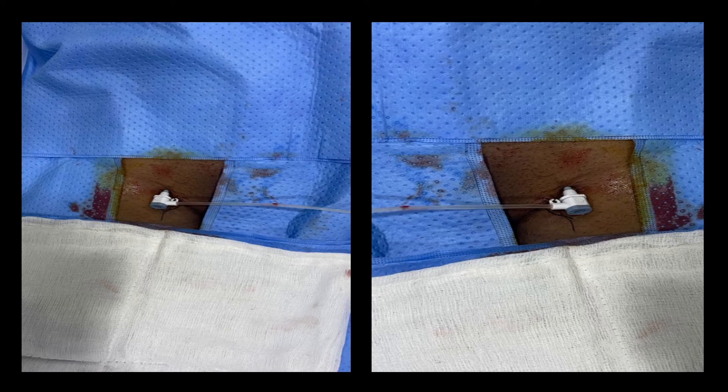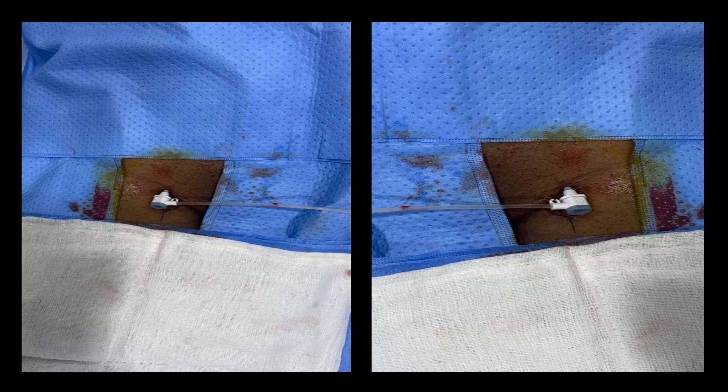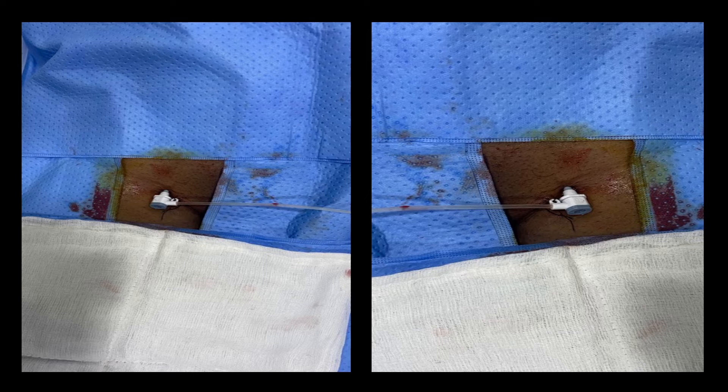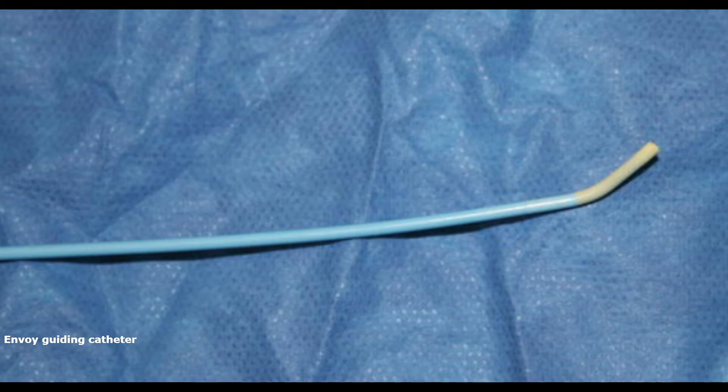After obtaining proper patient consent, the patient was shifted to the DSA suite and placed supine. General anesthesia was administered, bilateral groin was painted and draped, and bilateral femoral artery cannulation was performed using an 8-French femoral sheath. A 6-French Envoy guiding catheter was passed from the left femoral artery and placed in the right ICA for cross-flow and road map of the left ICA.